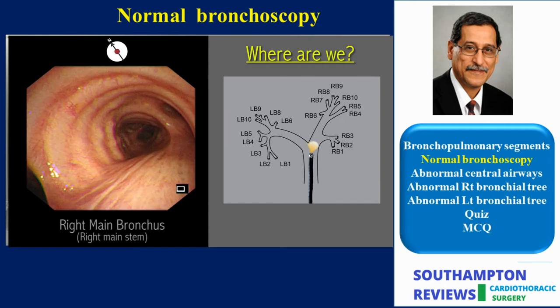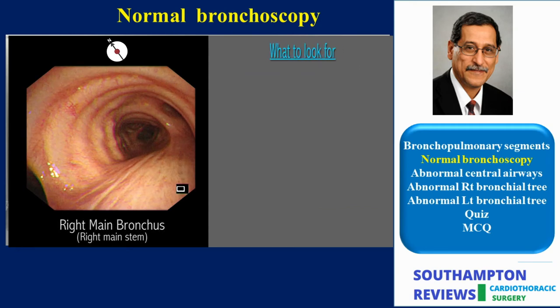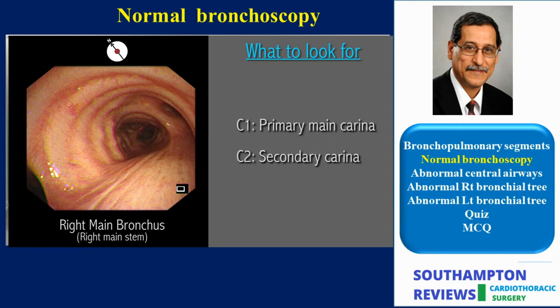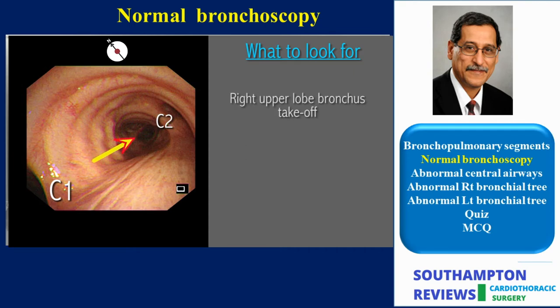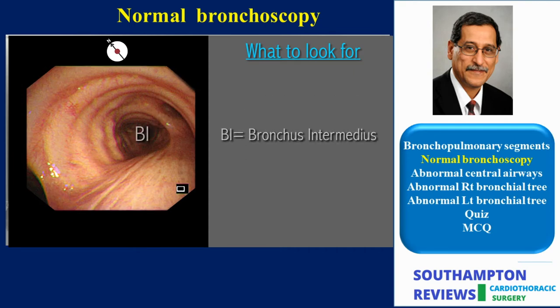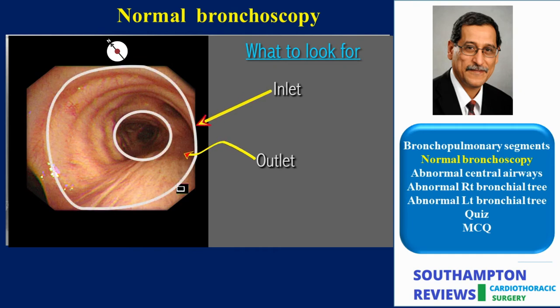Next we will examine the right main bronchus. This is a short 2 to 3 cm bronchus in vertical continuity with the main trachea. To define its territory precisely we have to define its inlet and outlet, using the concept of thinking and seeing carinae first. We have already defined the primary carina C1, which defines the inlet of the right main bronchus. The outlet is defined by the secondary carina C2, between the right upper lobe and the bronchus intermedius. Practically the right main bronchus spans the surface area from carina to carina, i.e. from C1 to C2.